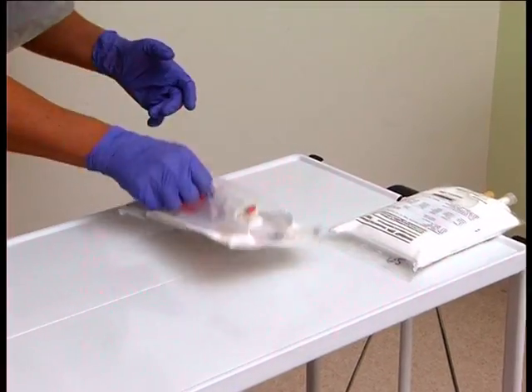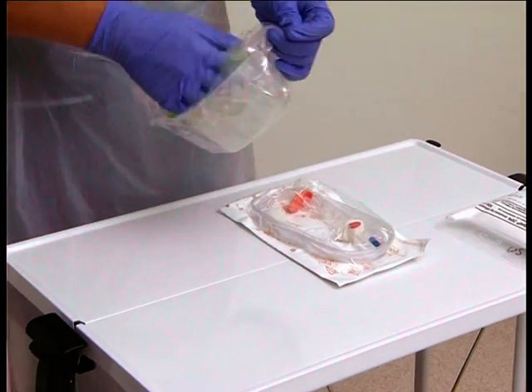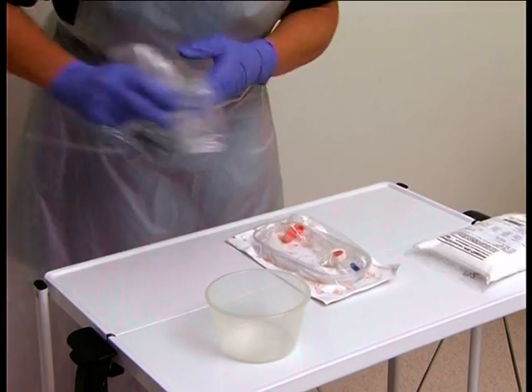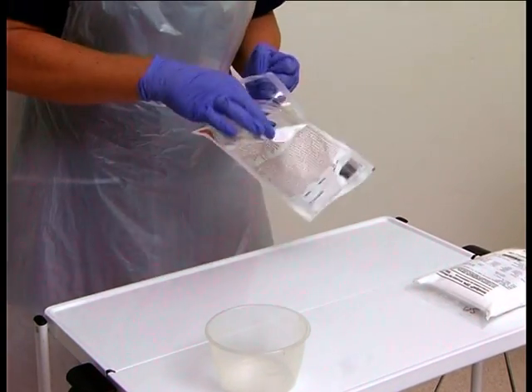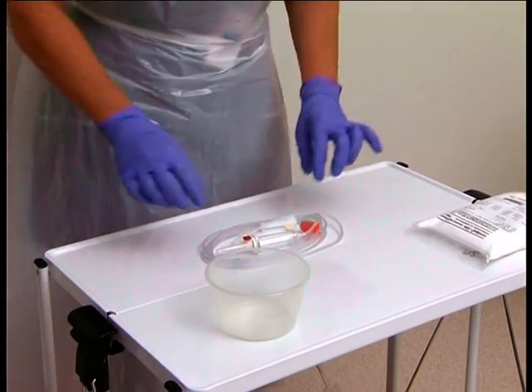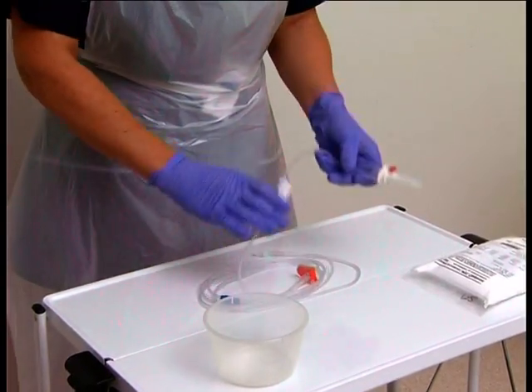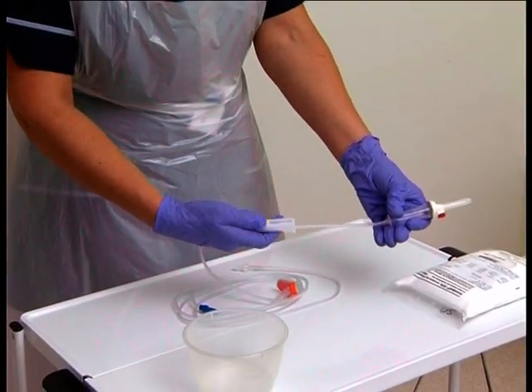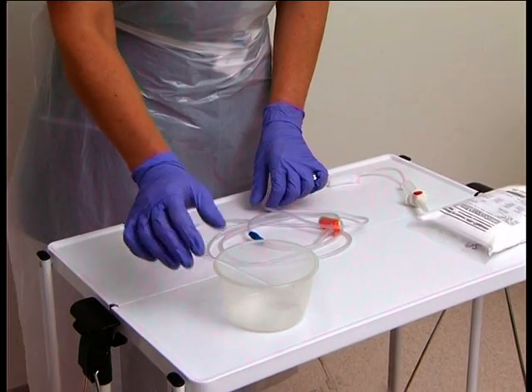Place the giving set without the filter on the top of the trolley. Open the bowl and then the giving set. Make sure that the giving set is not twisted or knotted. Close the roller clamp. Put the end of the giving set into the bowl.